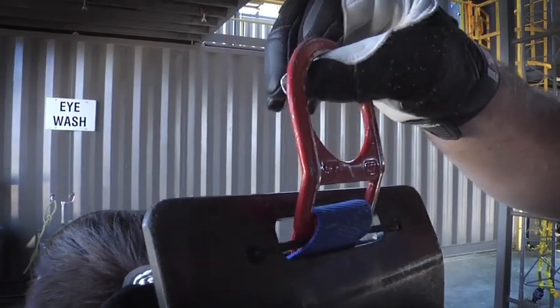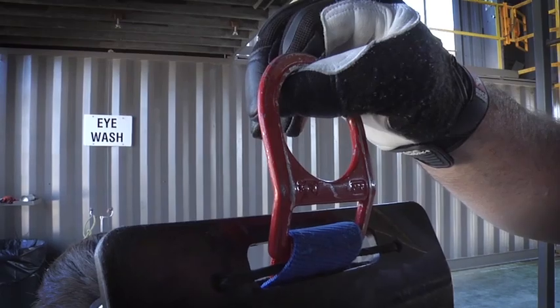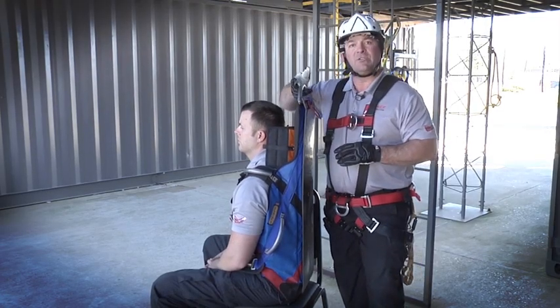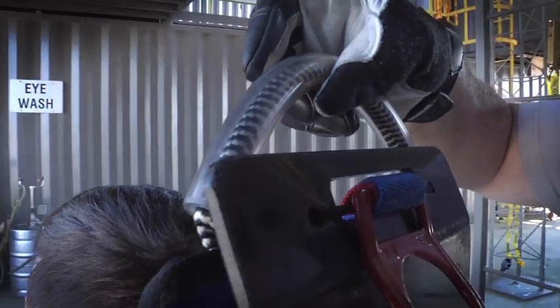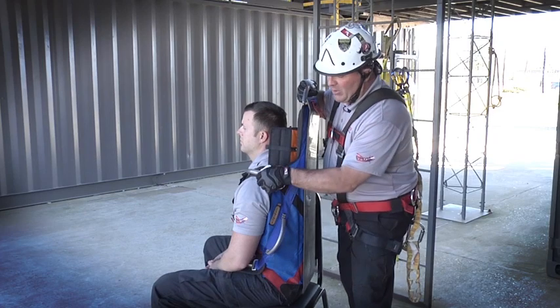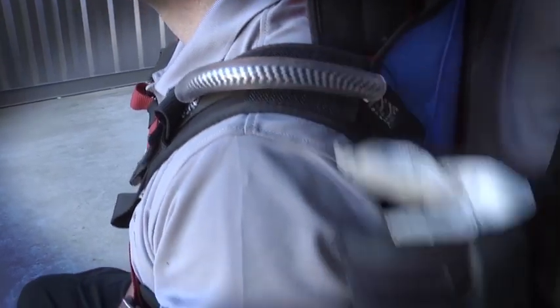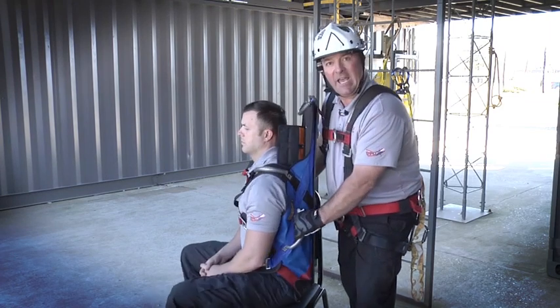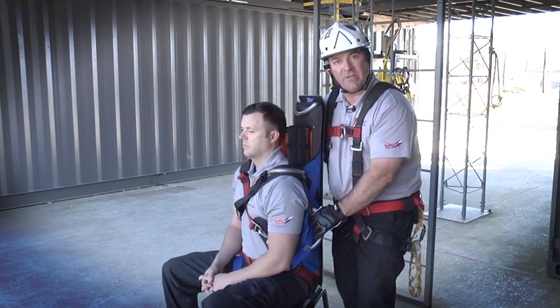At the top here we have a red lifting bull ring. This is one of our attachment points when we lift. On the other side of it we have a drag handle — this is one of five. Note this is not designed for lifting. Down here we have two at the shoulders, one on each side, and one midway down. This really enables us to grab a handhold as we're pulling that patient through the confined spaces.